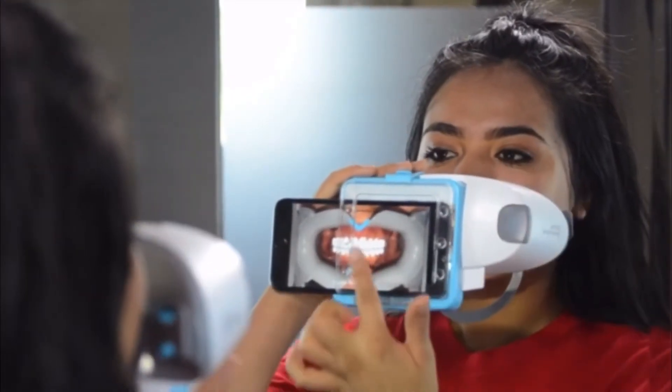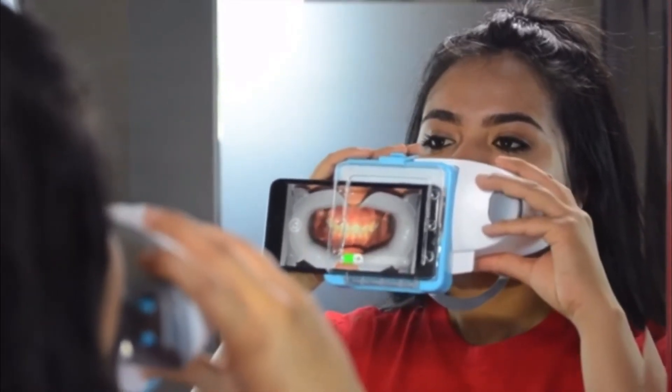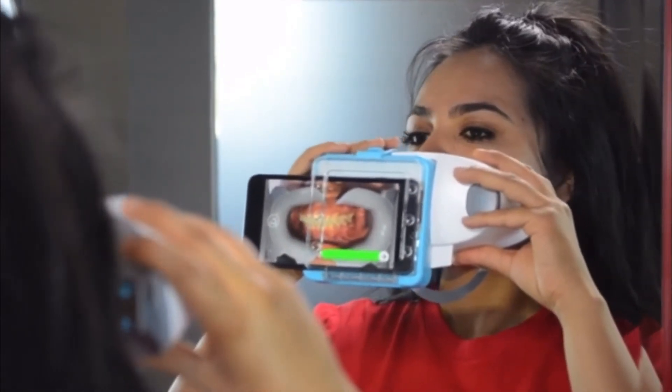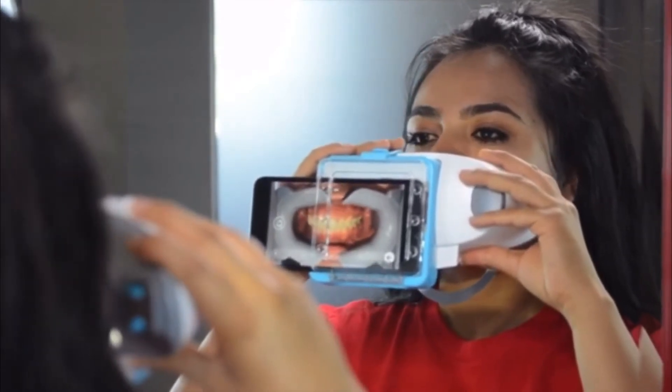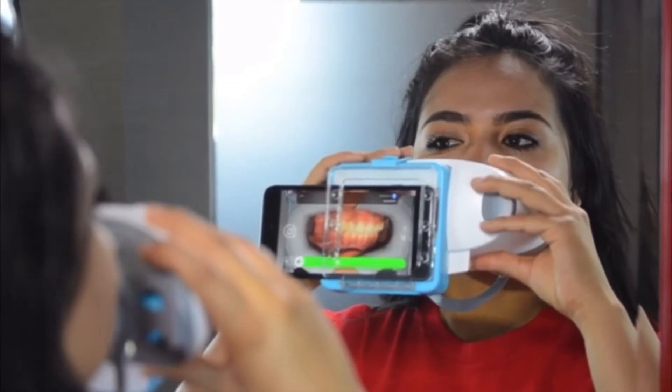Double tap to continue. Bite down. Shift the scan box to one side. Now shift the scan box to the other side. Back to the center.